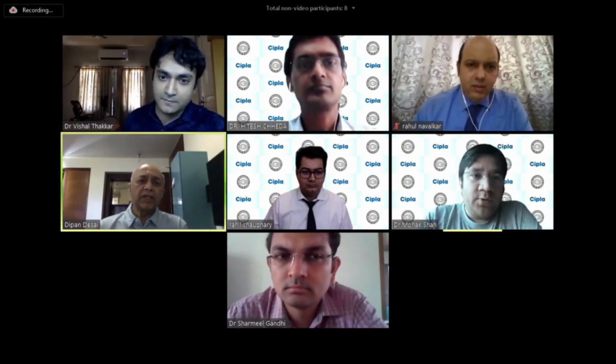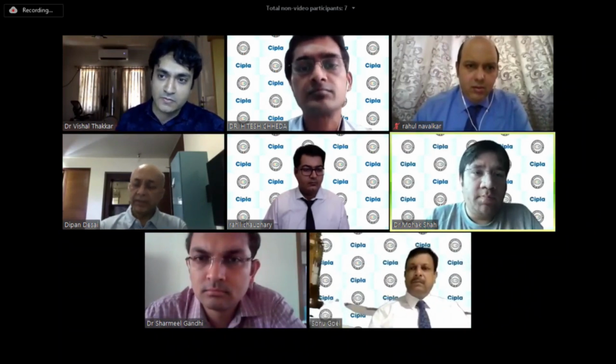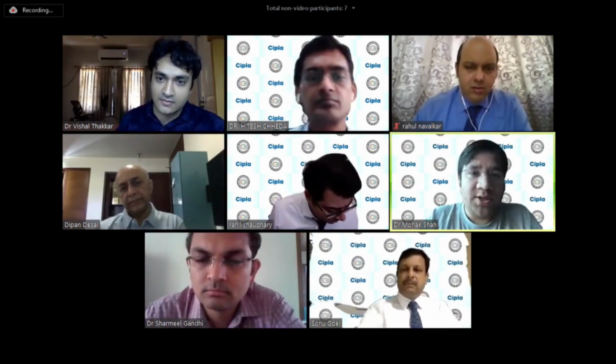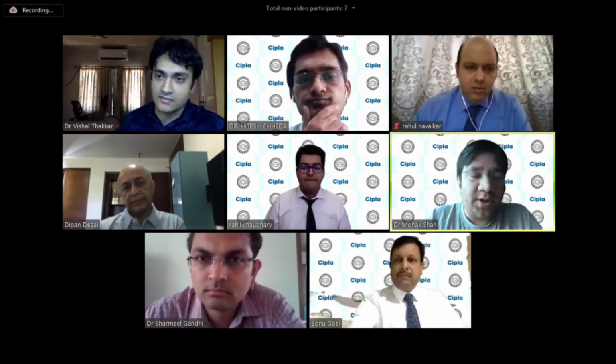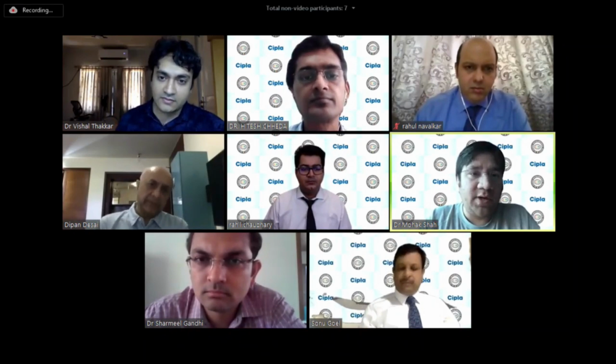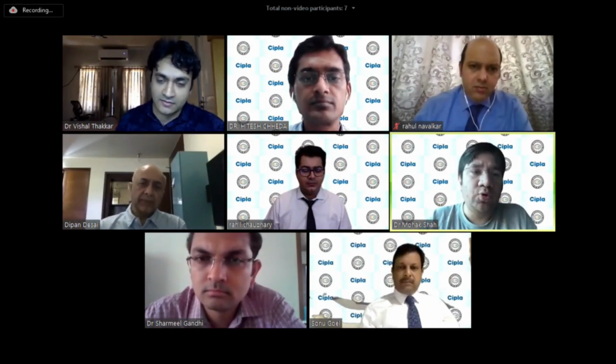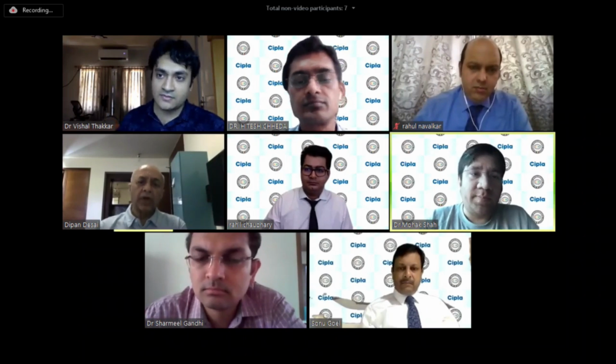To sum it up, use the Barrett online calculator, the Barrett Universal 2 formula, as well as the Barrett Toric calculator, because they are freely available on the internet. If you don't want to do that, just keep in mind, for normal eyes, SRK/T works very well. For longer eyes, you have to use Haigis, and for shorter eyes, you have to use Hoffer Q, or Holladay 1.